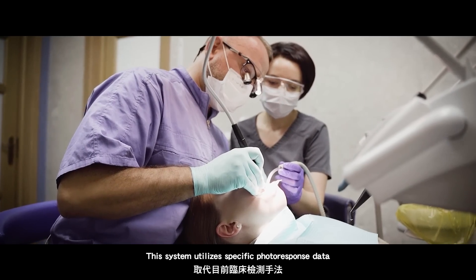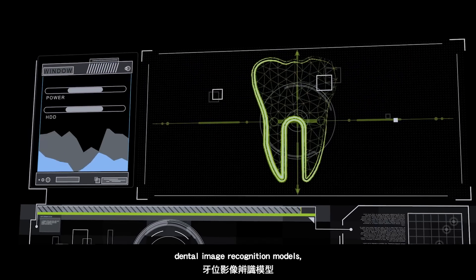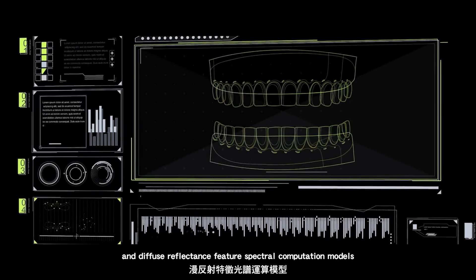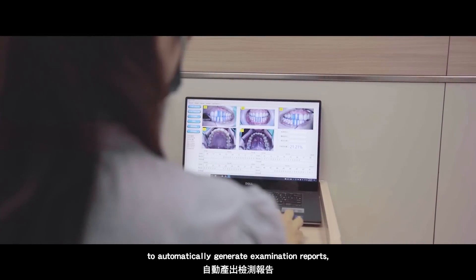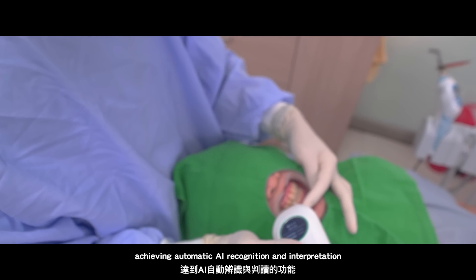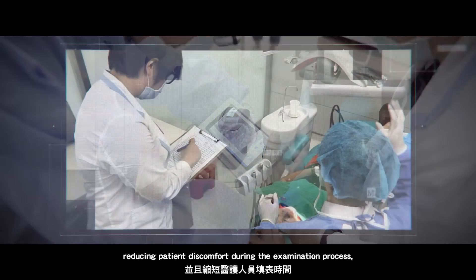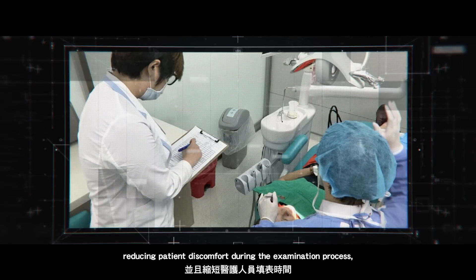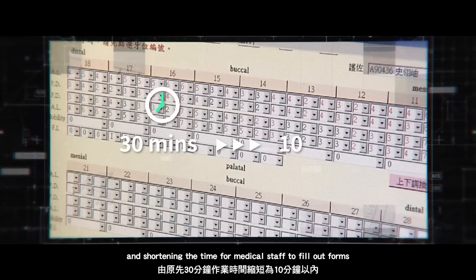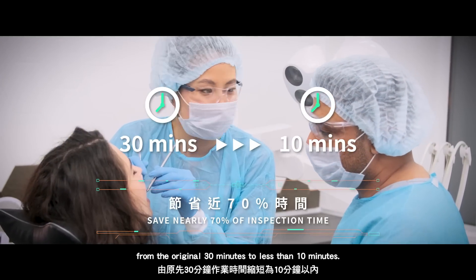This system utilizes specific photoresponse data, dental image recognition models, and diffuse reflectance feature spectral computation models to automatically generate examination reports, achieving automatic AI recognition and interpretation, reducing patient discomfort during the examination process, and shortening the time for medical staff to fill out forms from the original 30 minutes to less than 10 minutes.